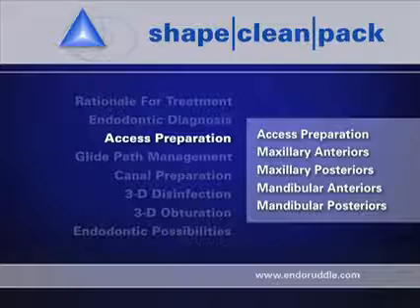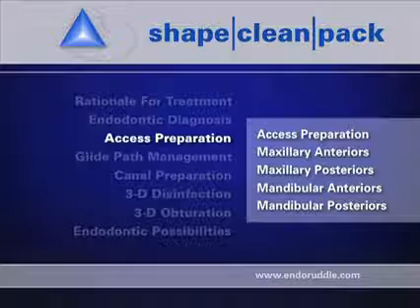Hopefully, in the examples you visualized, you've noticed how the various tools and concepts come together so we can get a predictably, successfully complete access cavity. With these concepts in mind, certainly you're going to discover more MB2 orifices in the days ahead.